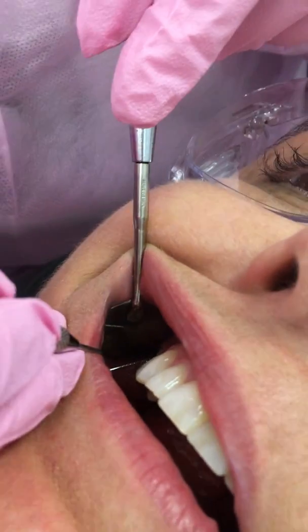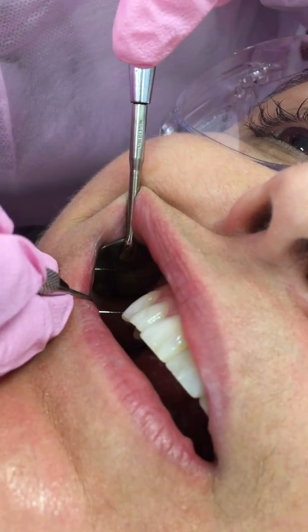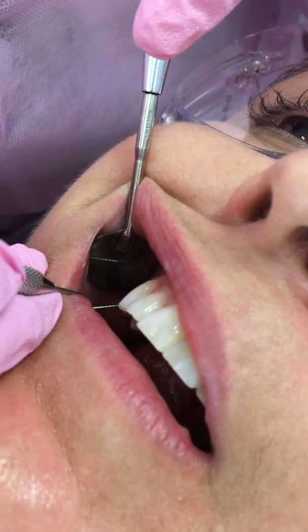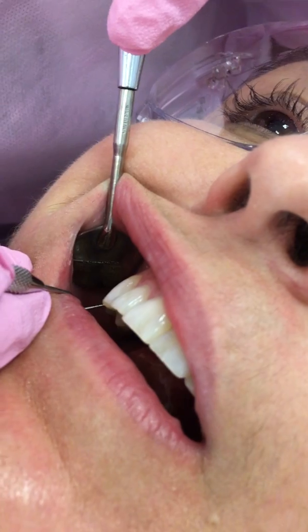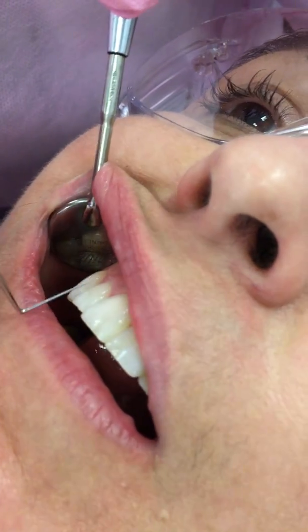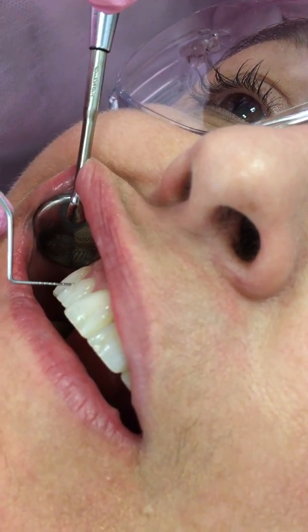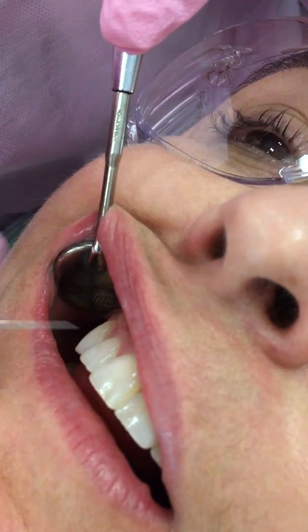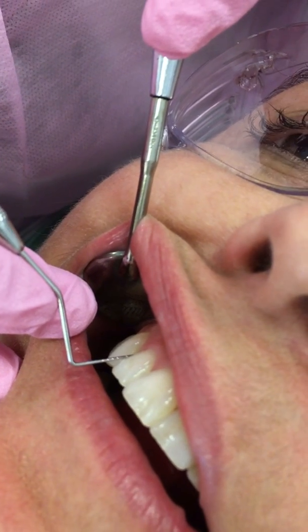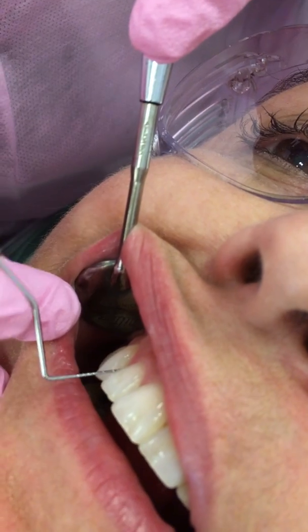I'm doing just little millimeter walking steps all the way around, and then I'm going to go into the col of the mesial here. I'm going to angle it somewhat so that I can get into the col, but I don't want to be straight because then I'm only at the line angle. I want to be in here. You see that? So I'm going to have to angle it slightly to get into the col and then straighten up a little bit.